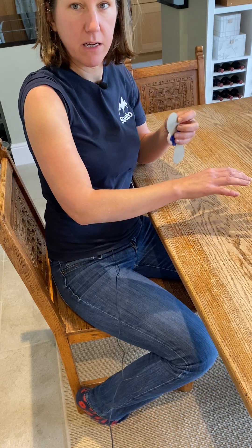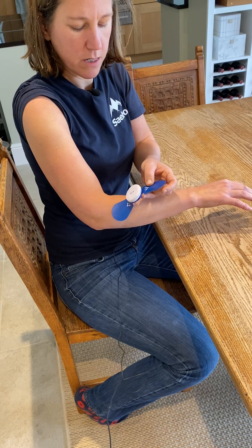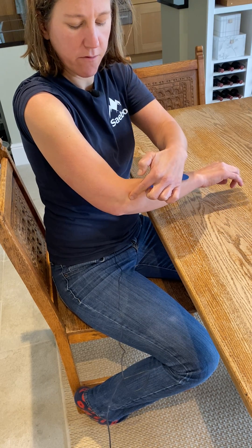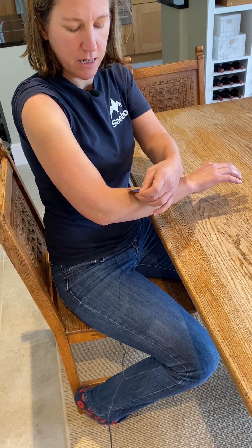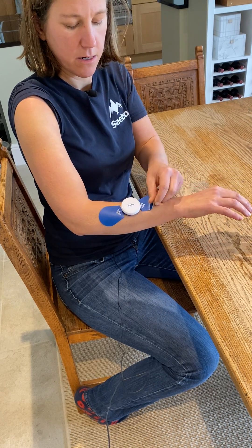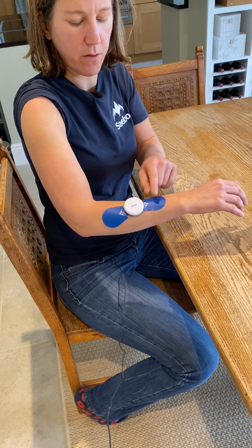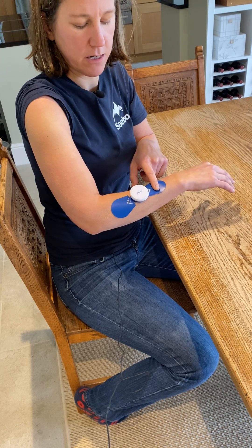For wrist and finger extension I'm going on to the forearm, and I want to get it on the muscle bulk — just down from the elbow you'll feel a fleshy part on the top of the forearm. I'm going at a slight angle in a line towards the elbow. I don't want it to be too near my wrist because I want to still be on the muscle bulk. So this would give me wrist and finger extension.